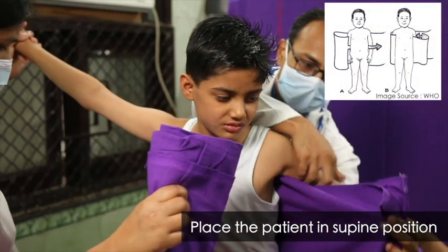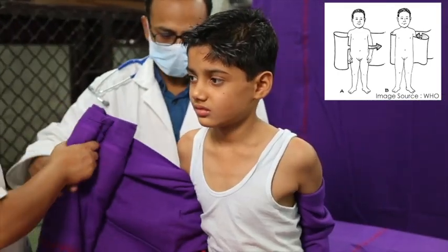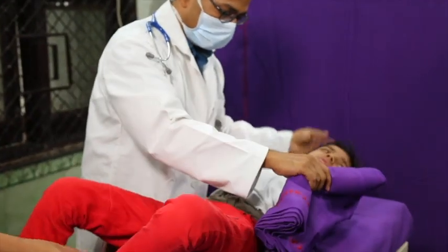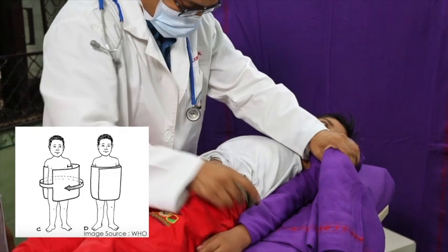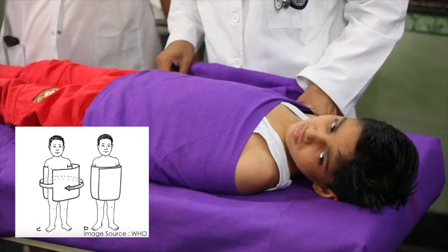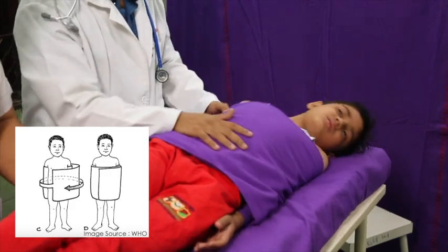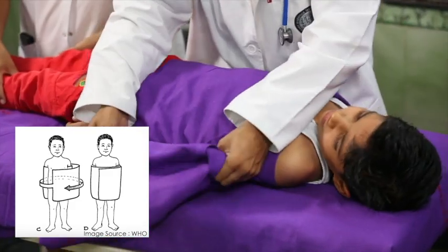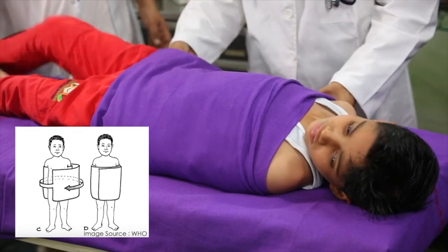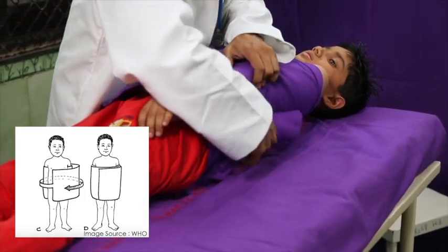Place the patient in a supine position and restrain using long folded sheets. One end of the folded sheet is pulled over the back of the child, looping through both arms. The other end is rolled over the arms and wrapped around the child, moving from back to front and then to the back. The lower end of the sheet should reach the wrist for effective restraint, and it should be rolled tightly to block movement of the forearms.